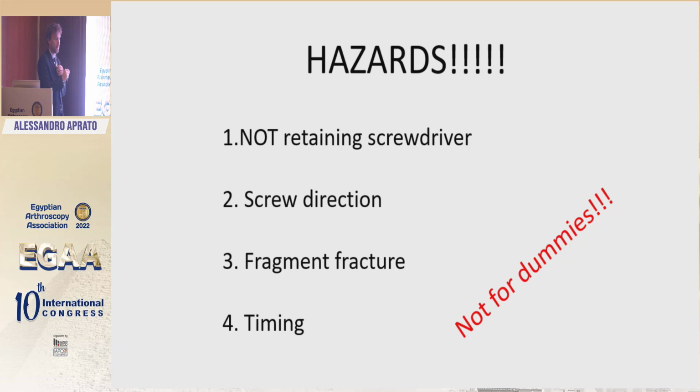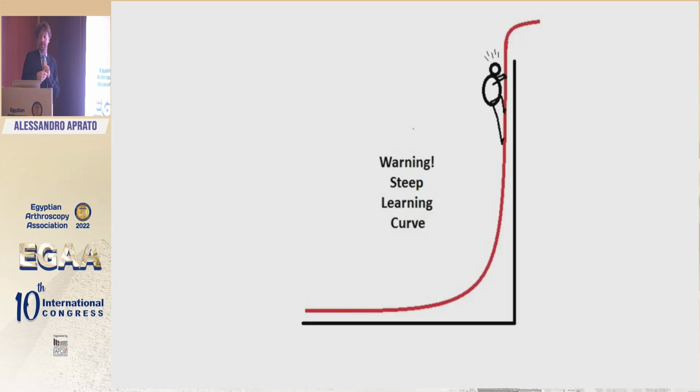The other thing is you can break the fragment while you're screwing it. Sometimes it happens, and this is a pity, but it happens. And the other thing is timing. It's a lot. We know that we can put a guy on traction for 2 hours, no more, because otherwise he will have a nerve palsy. So it's a steep learning curve. Yes, it is a steep learning curve.